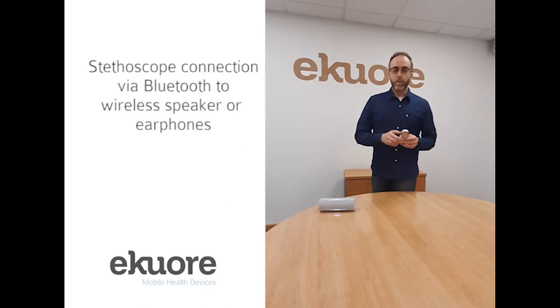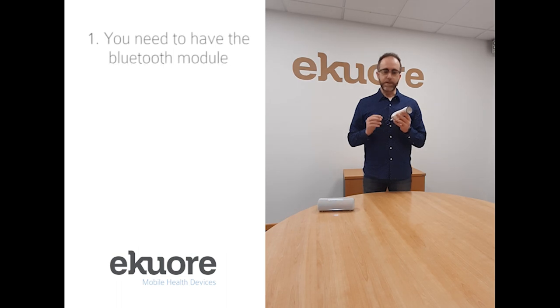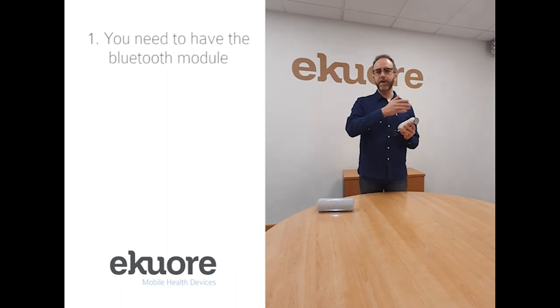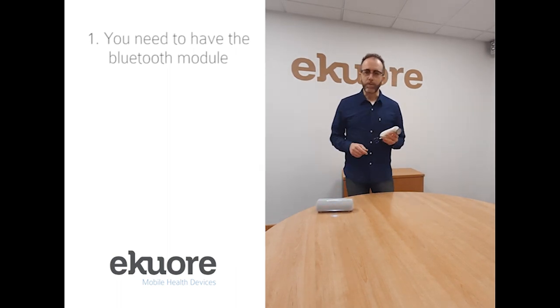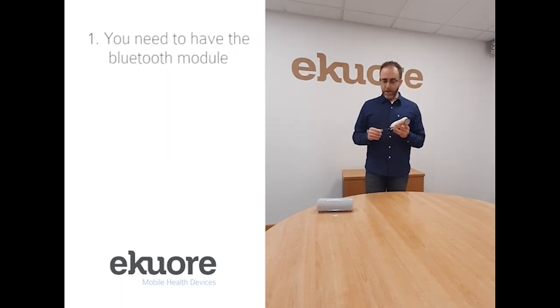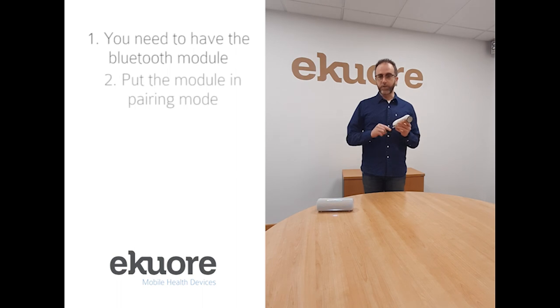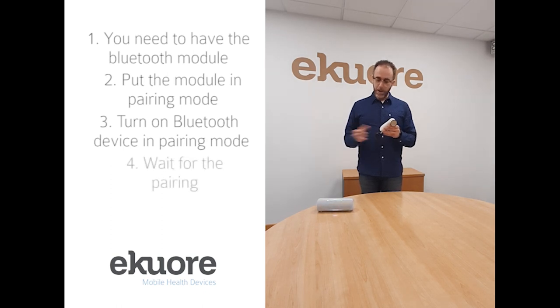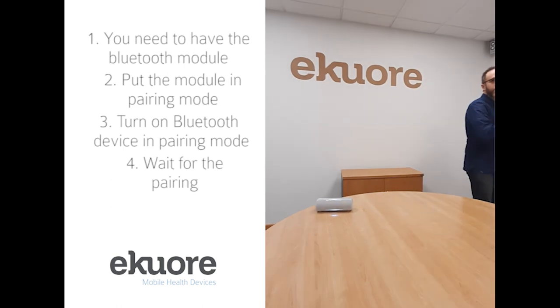We have the option with our Bluetooth transmitter of sending the sound directly to a wireless device — that can be a headset or a speaker like the one included in our premium kit. So you can just listen to the auscultation. It is really easy to pair the Bluetooth transmitter with any wireless speaker such as ours, so you can just pair it and listen to the auscultation in real time.